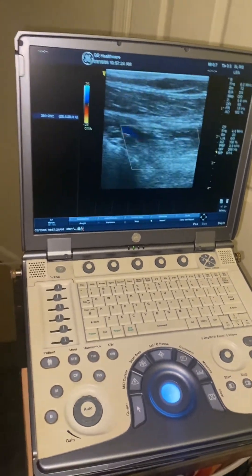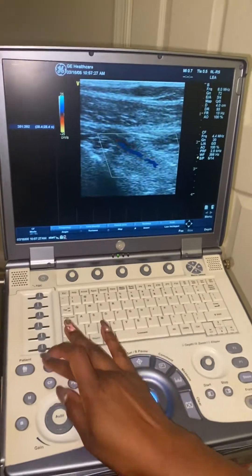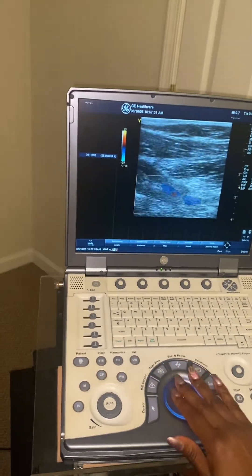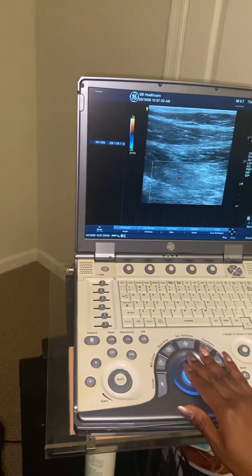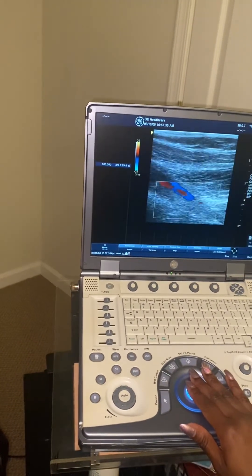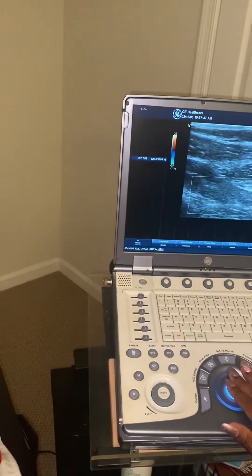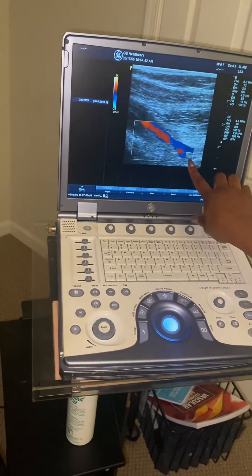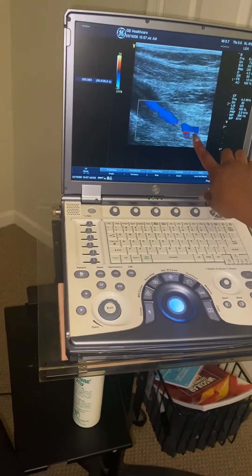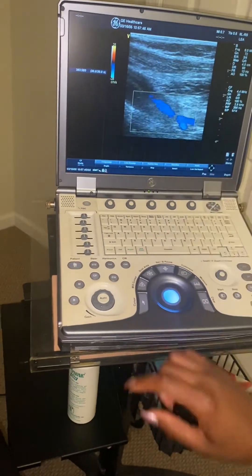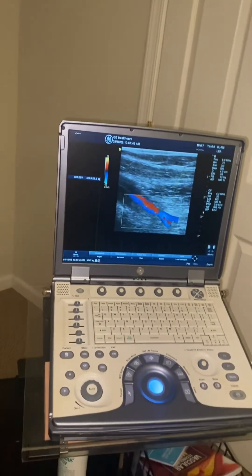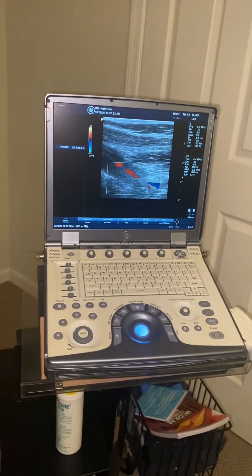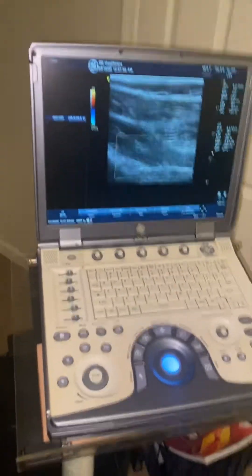At some point in this image, if I steer the box straight down, I would see the split. You can see your peroneal — you can see your split, your peroneal coming straight down and your posterior tibial artery right at that segment. You can choose to get your images there depending on the requirement at your facility.